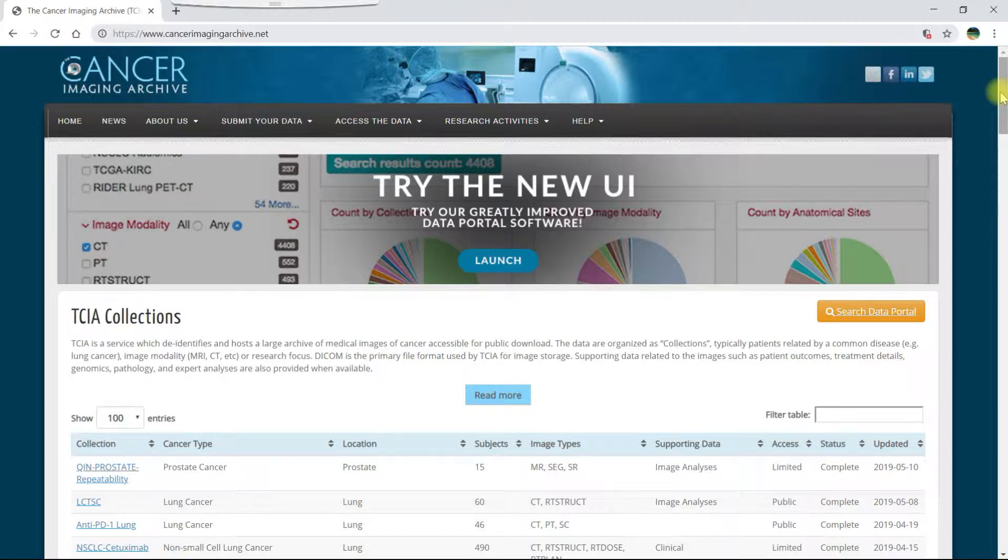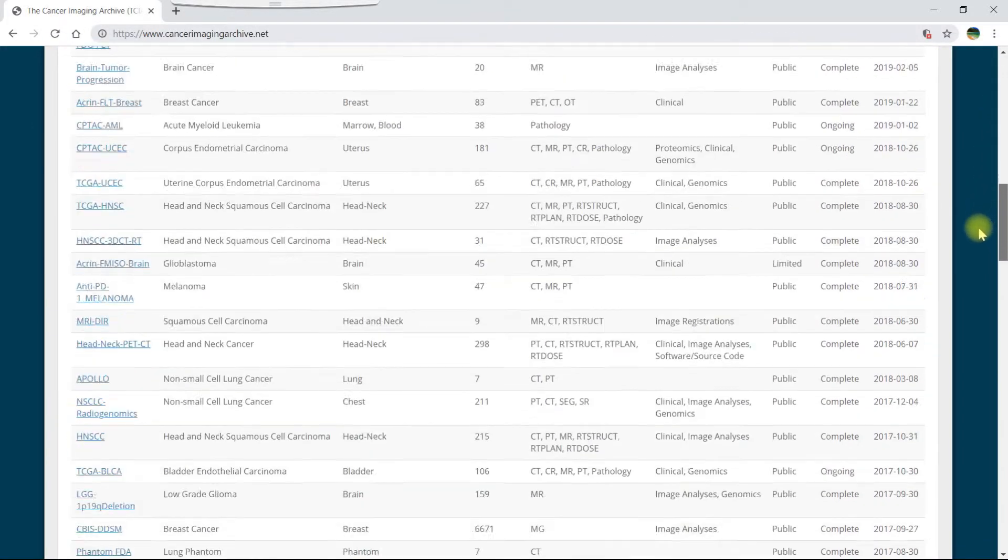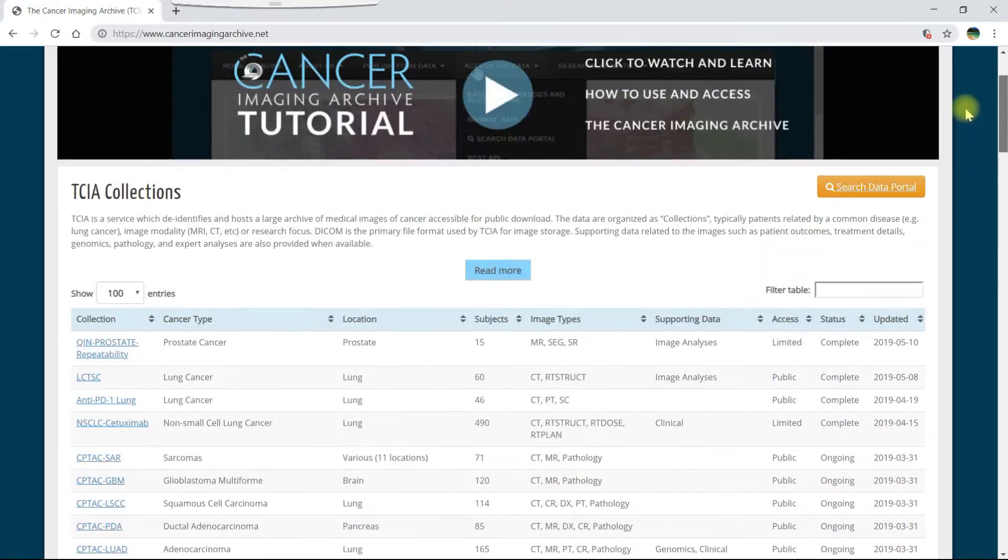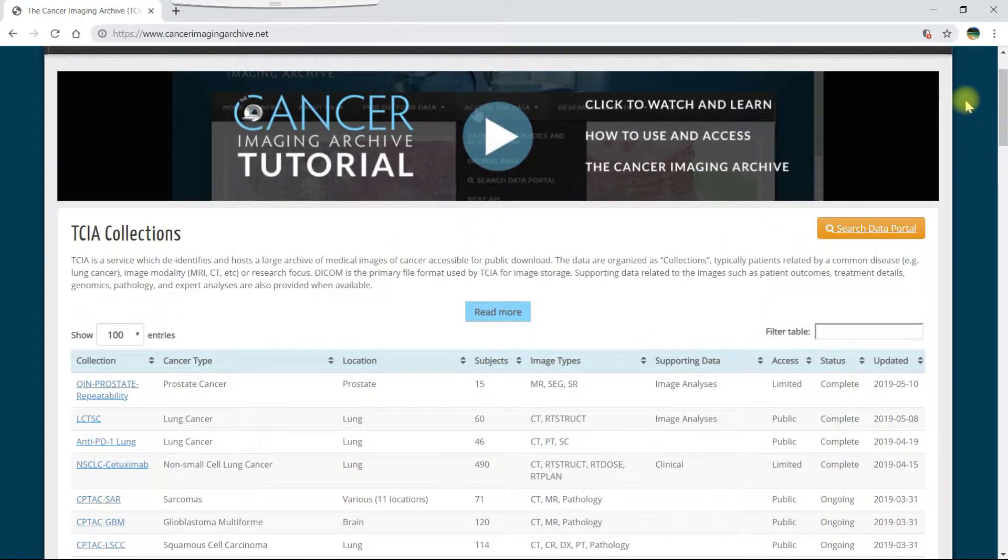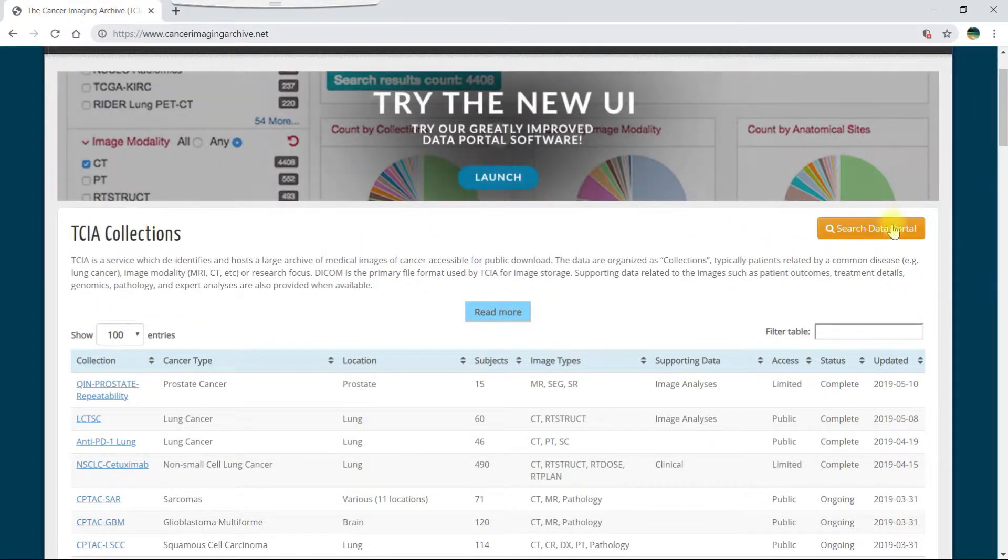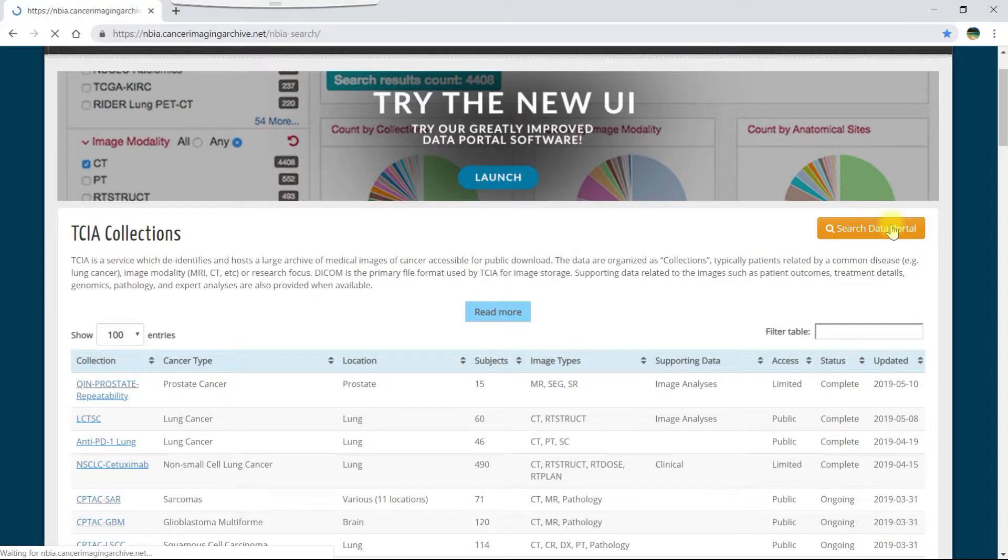You can download collections here, but if you are downloading multiple collections or need to search for specific data, it's easier to use the data portal, which we can start by clicking the search data portal button.